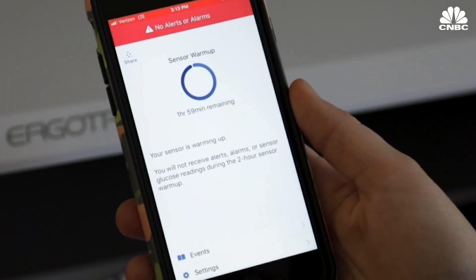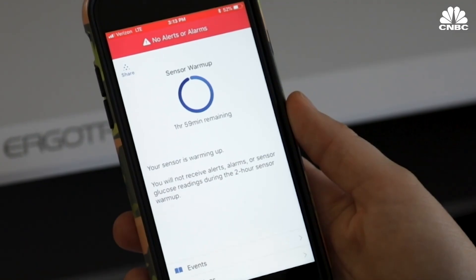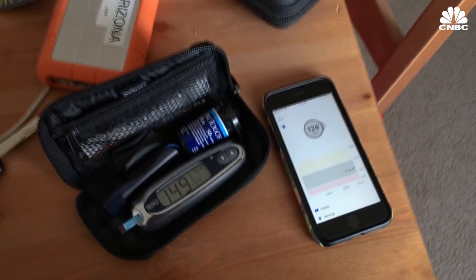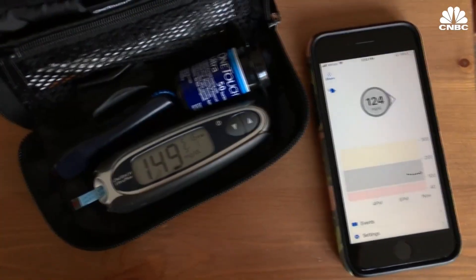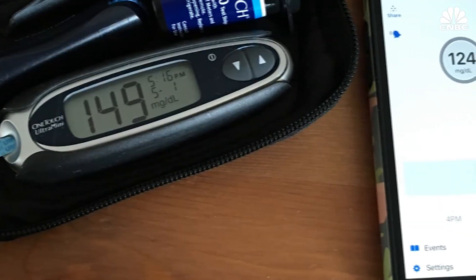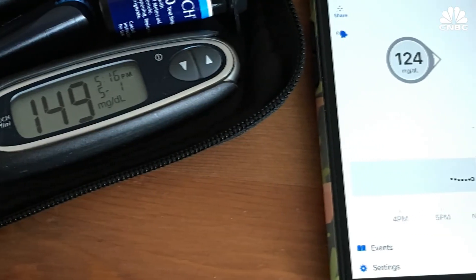The G6 app immediately identifies the sensor and starts its two-hour warm-up. After two hours, the G6 said my blood sugar was 124. But my meter was showing me as 149, so right off the bat it was 25 numbers off.